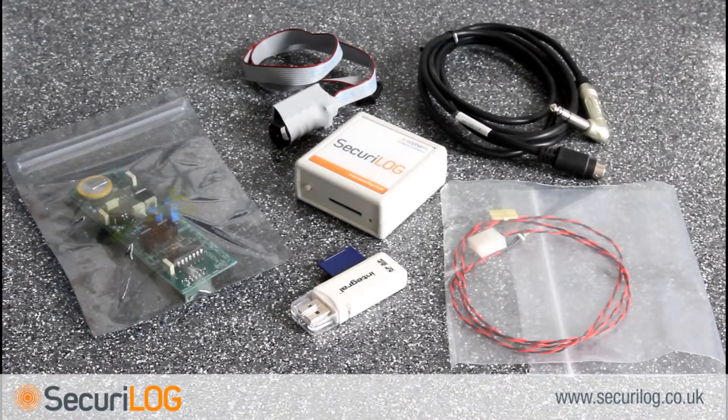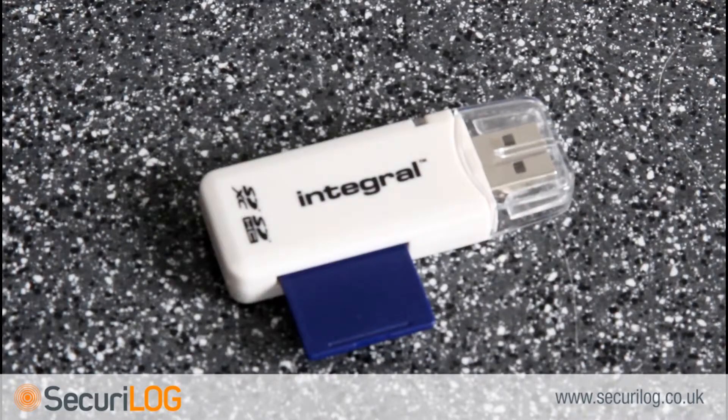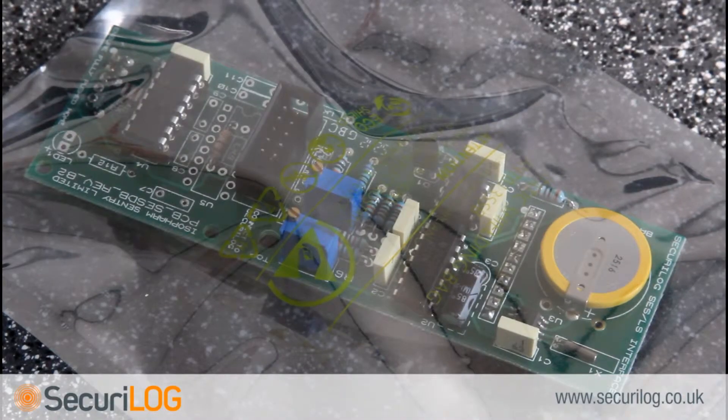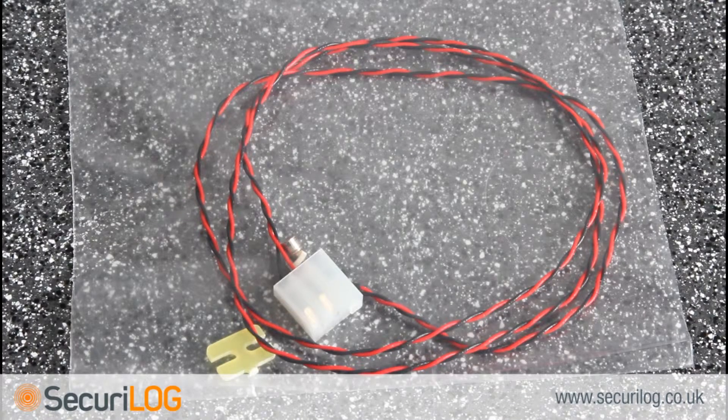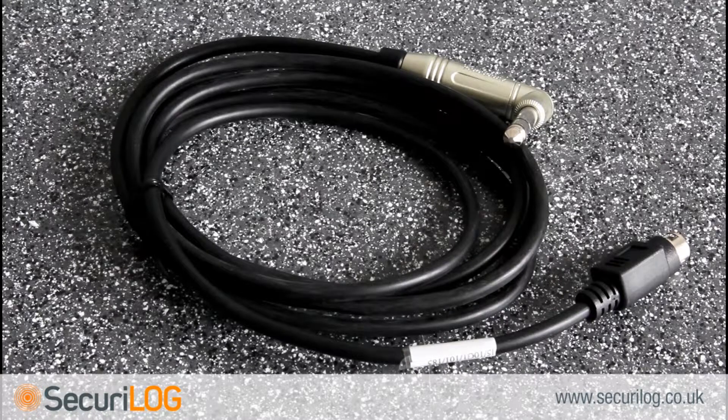The Securilog Kit 7B contains: a benchtop Securilog, a memory card and adapter, an Isofarm daughterboard, a bulkhead fitting with a ribbon cable, a secondary temperature sensor and H-clip, and a communication cable that in this installation also doubles as the power cable.